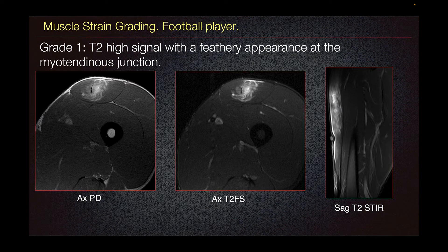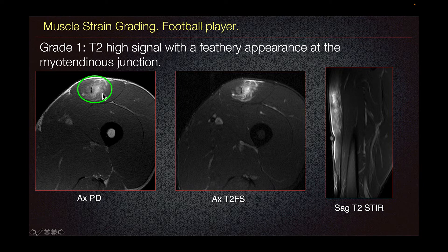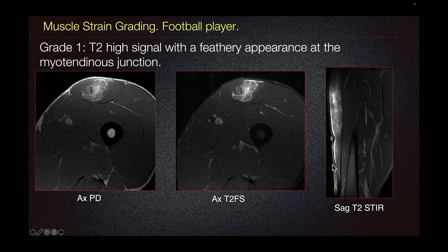This makes muscle strain grading for rectus femoris unique. For example, in this patient — a football player — grade 1 strain is demonstrated by T2 high signal with a feathery appearance at the myotendinous junction. This low-grade or grade 1 strain predominantly involves the inner muscle belly around the central aponeurosis. On axial T2 fat sat imaging, we can see this feathery appearance with no discontinuity of the fibers. The sagittal T2 demonstrates the craniocaudal extension.